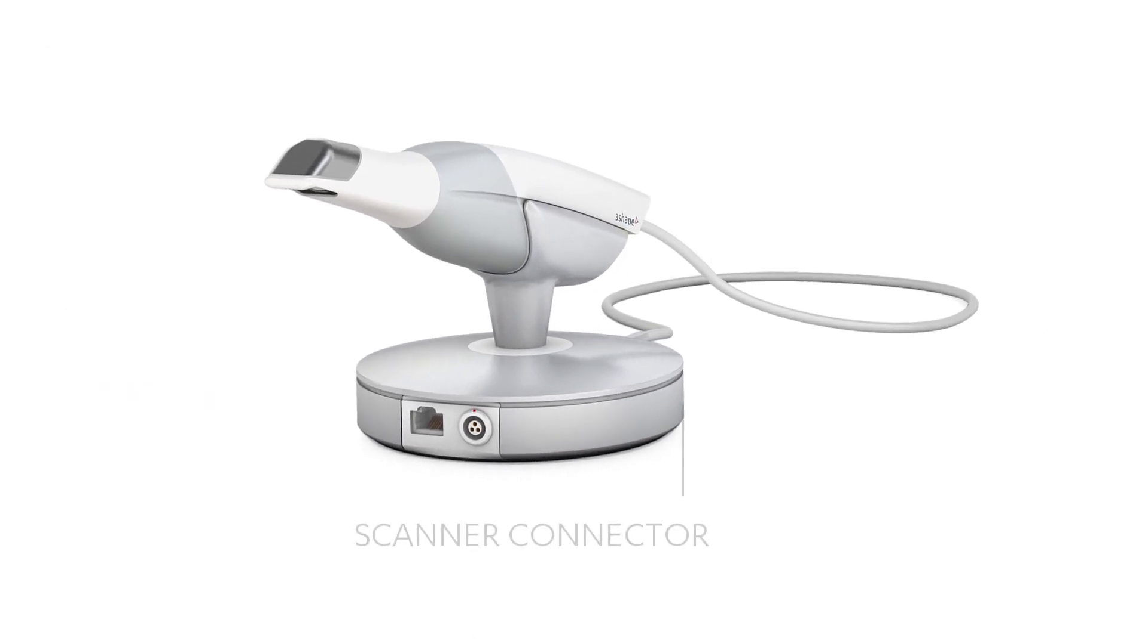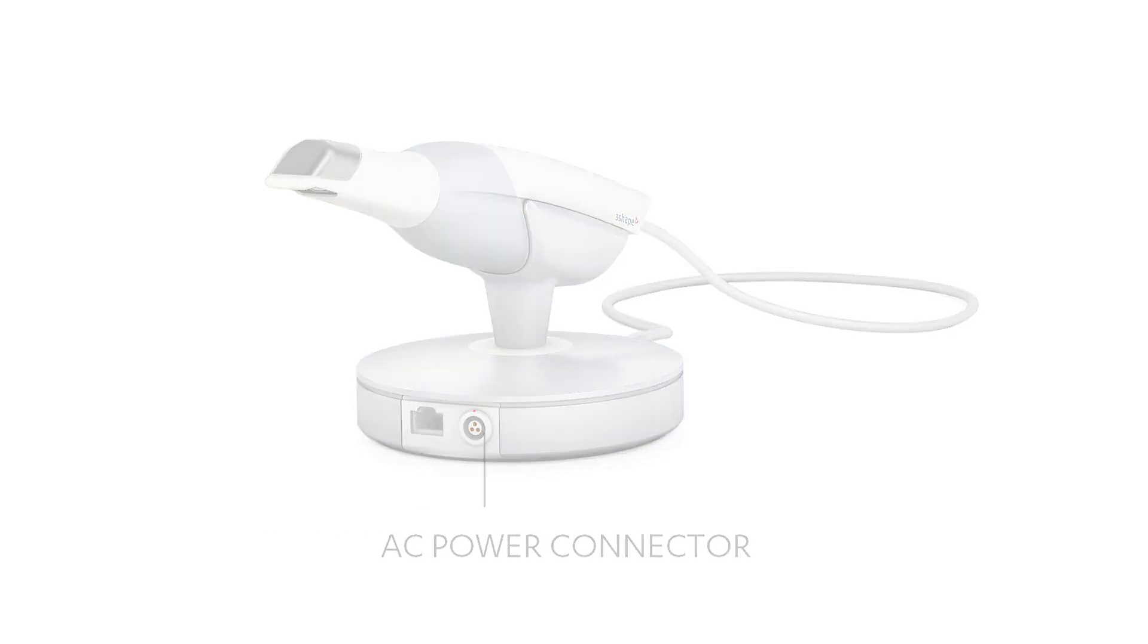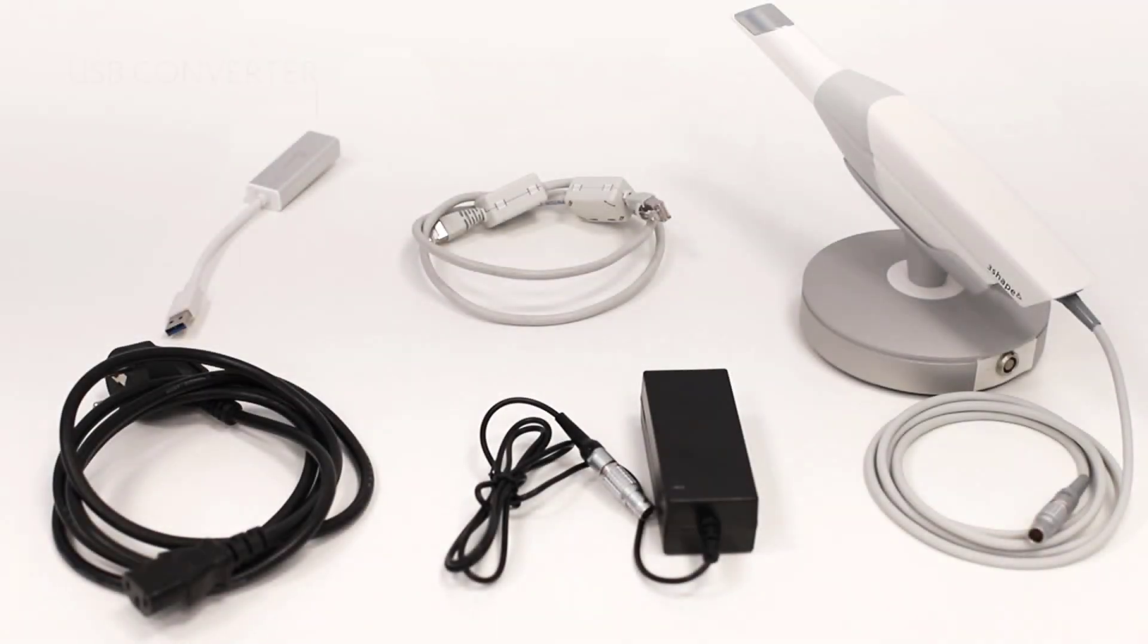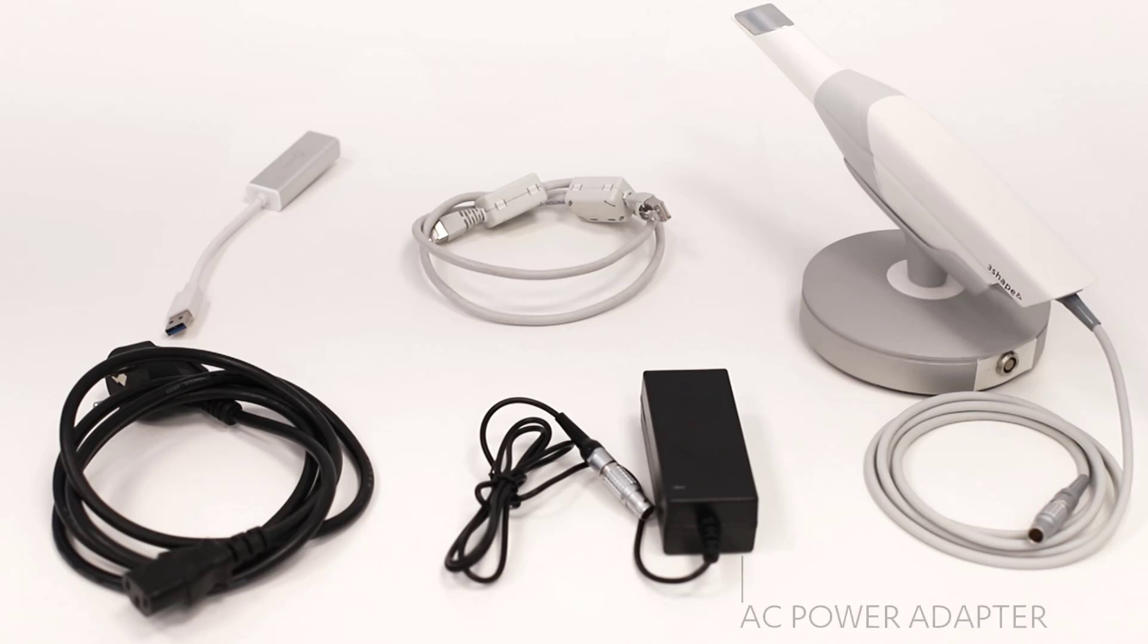It has connections for the Trios scanner, an Ethernet port, and a power plug. The package includes a small USB to Ethernet converter, an Ethernet cable, and the power adapter with matching power cord.